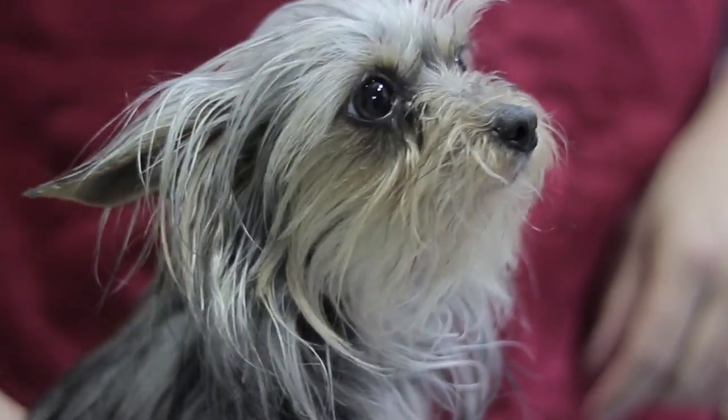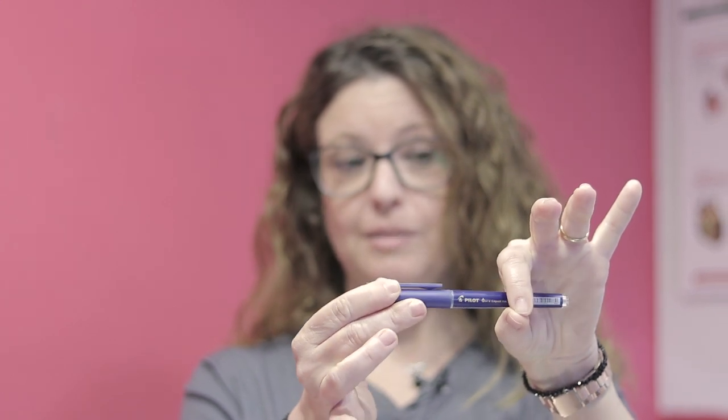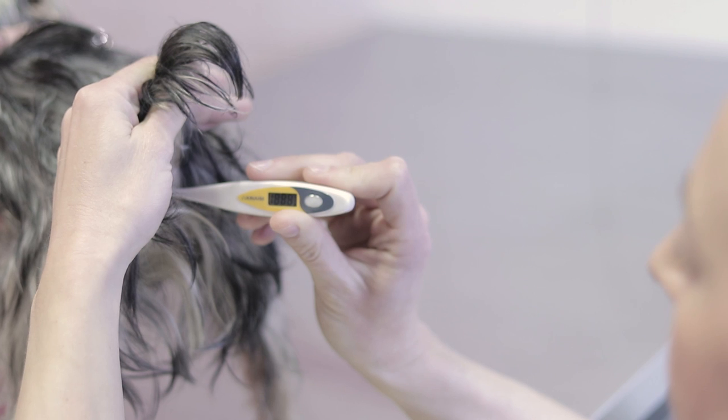In today's AnimalWise video, we are going to show you how to properly measure the temperature of your dog. This requires a rectal reading which is part of any dog's basic care needs.